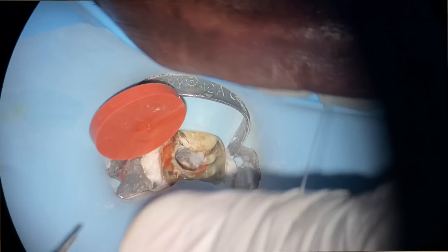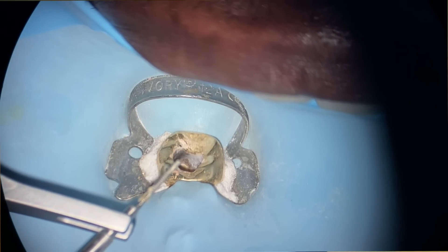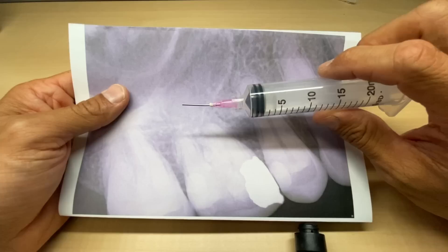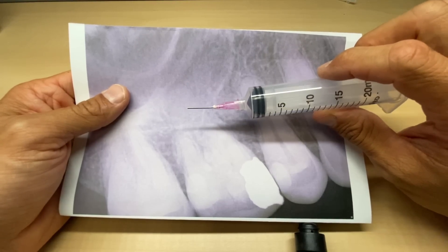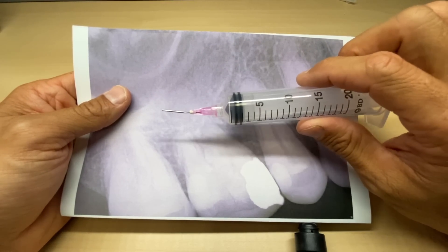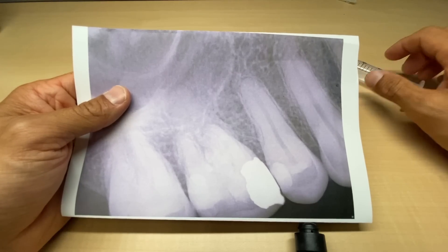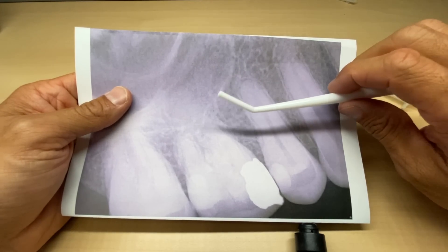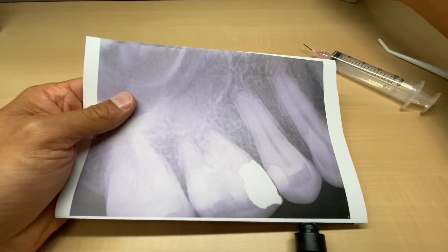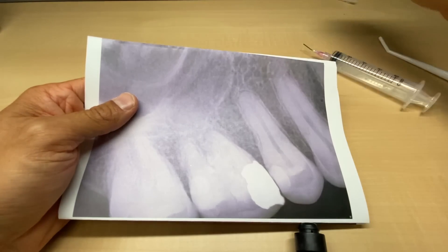Hey, this is Ash from All Things Dentistry, the place where we're passionate about sharing those unwritten hints and tips in dentistry. Today is something I've been wanting to talk about for years, and finally a case is presented. I'm going to talk about one of these. We're going to use some irrigation, a hedstrom file as well — let's get into that real quick.